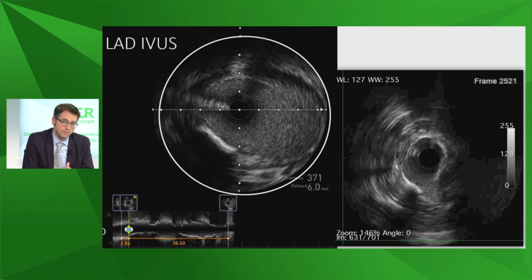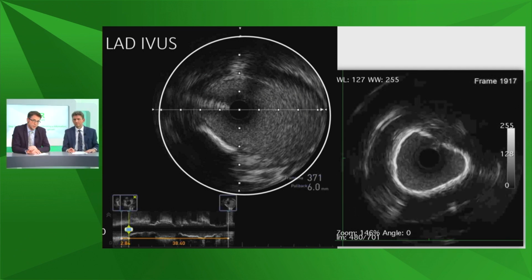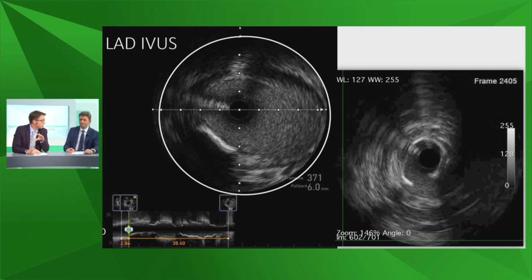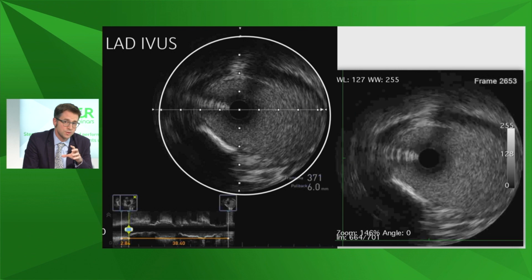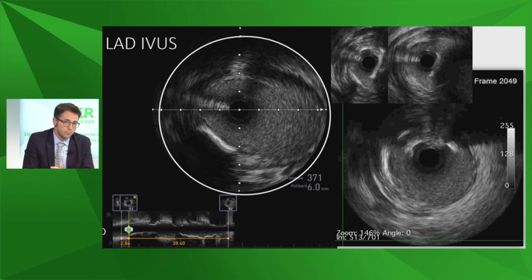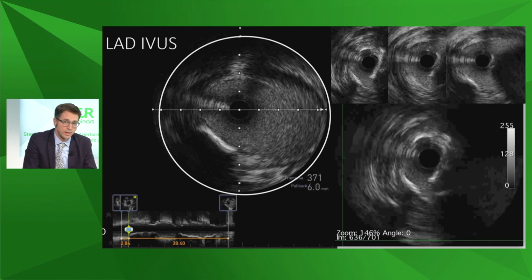Yeah. And again, this causes me concern, and we've already had comment from our participants that this is the point at which this procedure may fail long term. This is where we may see restenosis if you don't expand the stent. And so actually I took a view then to move to optimizing the LAD pre-stent as well.